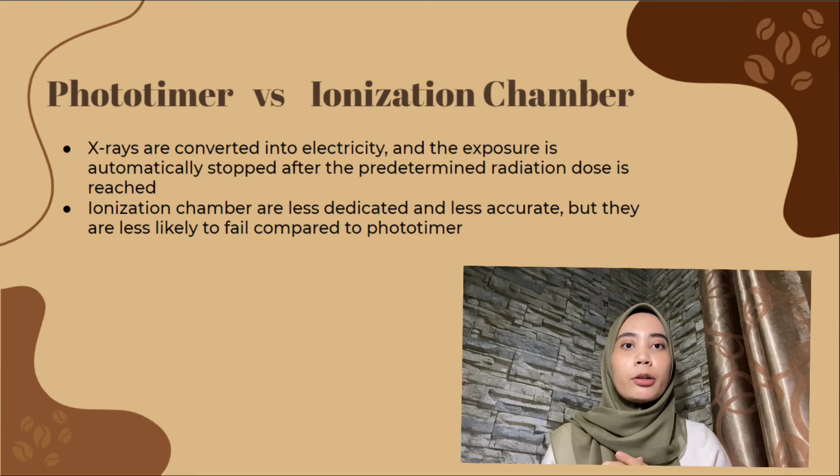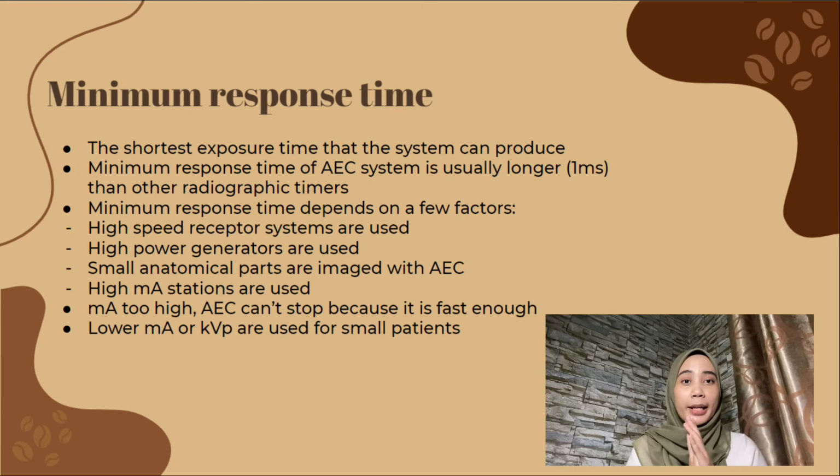The ionization chambers are less dedicated and also less accurate, but they are less likely to fail compared to the phototimer.